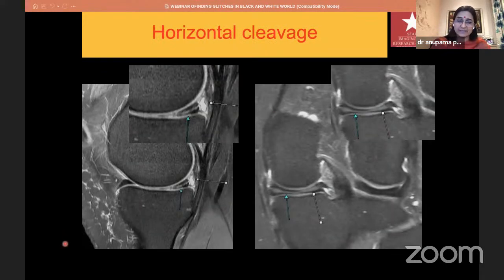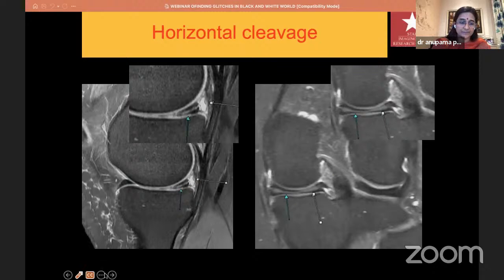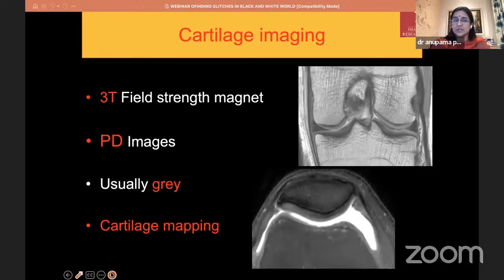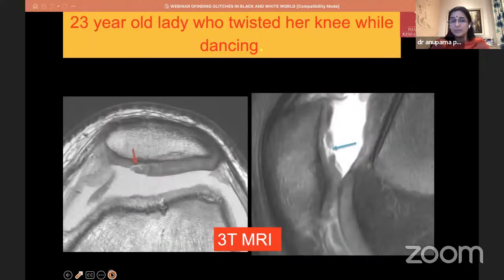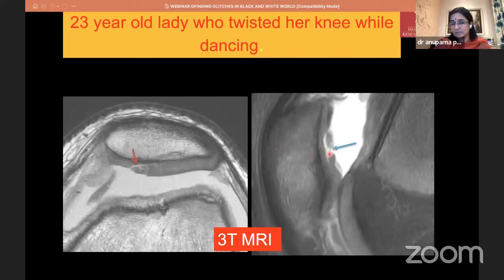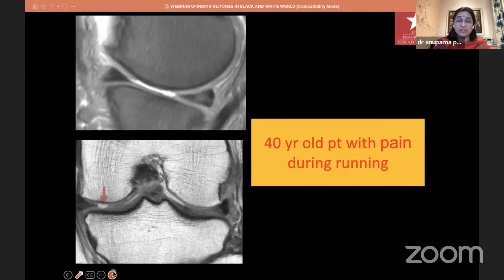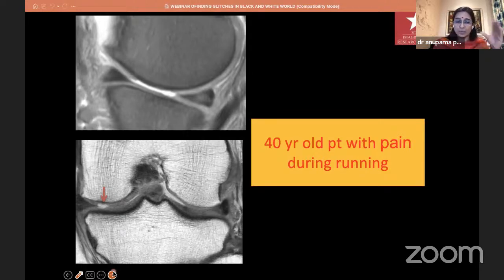Horizontal cleavage tears are pretty simple to identify — they are horizontal tears running through the center of the meniscus, usually associated with a parameniscal cyst. Finally, cartilage imaging: these kinds of images are not possible unless you use a 3 Tesla field strength magnet. The best sequence is proton density sequences — cartilage is gray, fluid is bright, and any abnormality is beautifully picked up. On these images you can actually see the tear going through the cartilage and visualize the chondral defect. This is only possible with high field strength imaging.